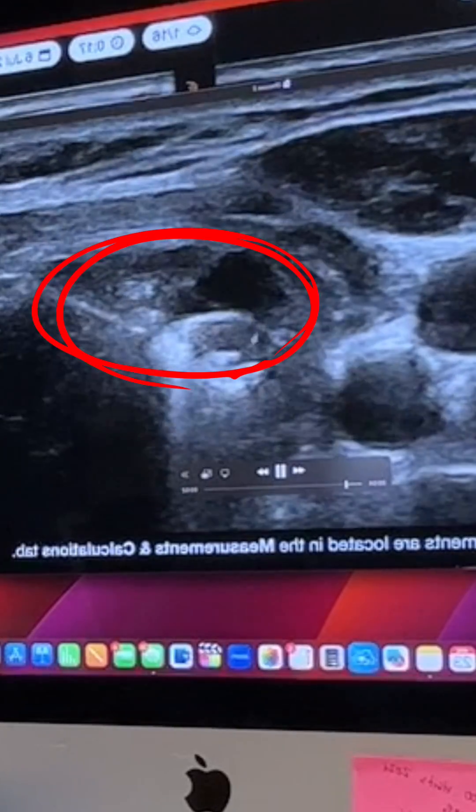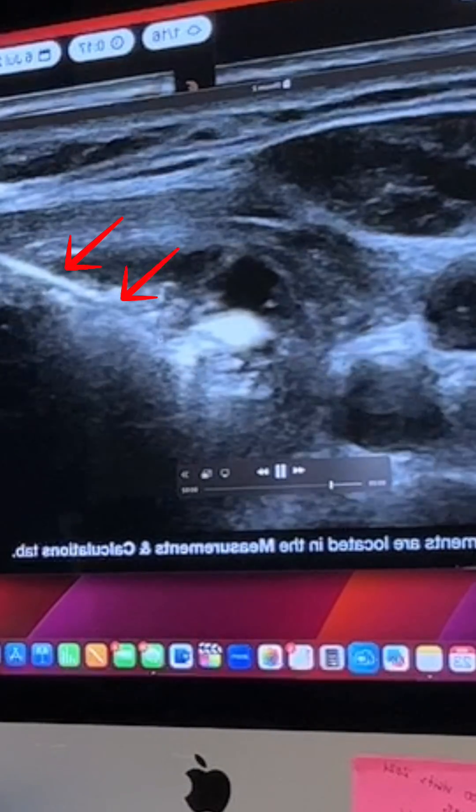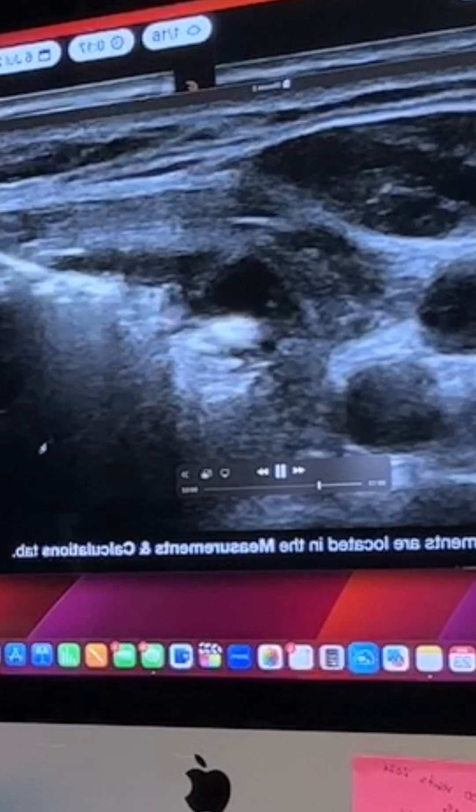Look at this. You can see the nodule here and that line is the probe. All of the white stuff you see moving — that's the probe destroying the nodule from the inside out.